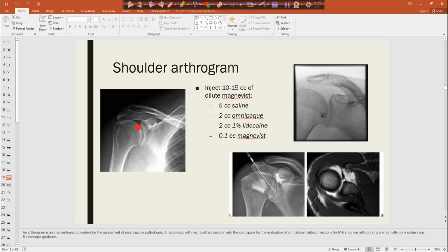But yeah. And sometimes, as they're walking them back to X-ray, they ask them, are you claustrophobic? So now that you guys have seen both sides, the X-ray and the MR side, you get a full perspective of what happens and all the steps involved, okay? So if you do an arthrogram, make sure they're not claustrophobic, and if you see that they're a bigger patient, maybe take them down to MR and say, let's see if we can do a trial, a dry run, to make sure that they can get through this.